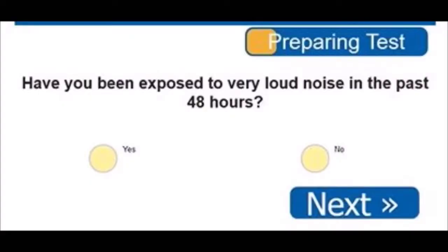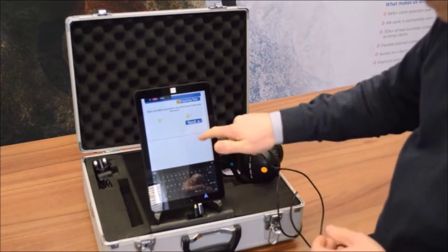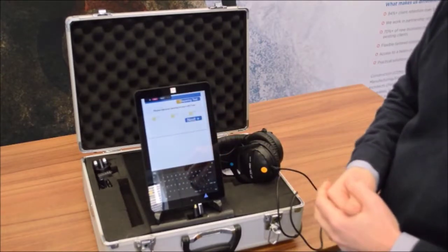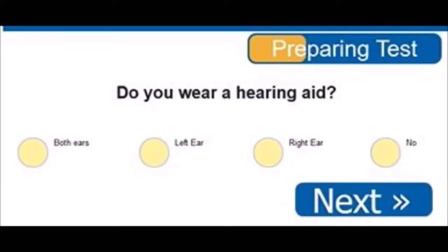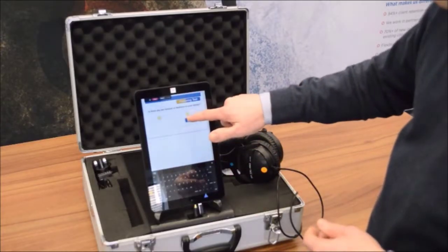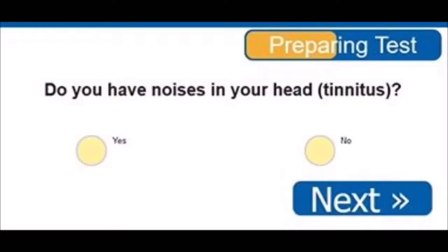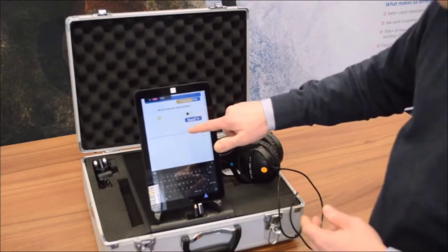And so the beginning of that is a few preparatory questions where we're looking for the background to see what kind of risk profile we've got. And so I can answer personally on a no to that. We've got some medical questions. And so being exposed to noise which is quite loud in the last 48 hours is a typical question. It's something which complies with the guidance. I can rate my hearing, which in my case is good, I'm glad to say. Again, it's good. I don't wear a hearing aid. I haven't suffered any trauma. No ear disease. No deafness in my family. No, and no tinnitus, or giddiness, no drugs, no naughty hobbies I know of.